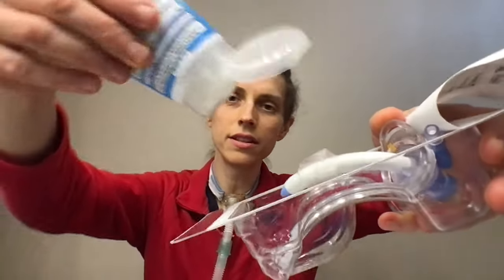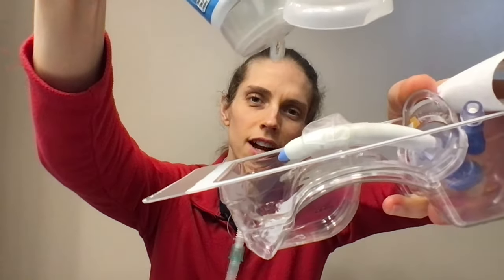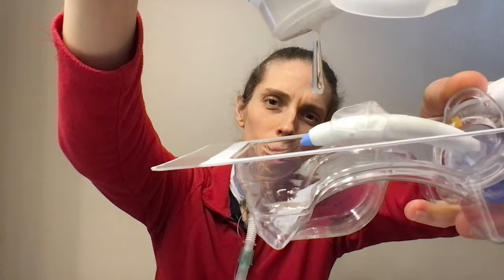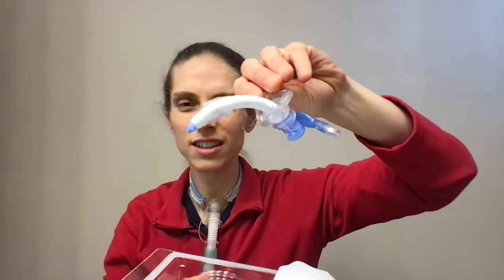Okay, got this tiny little bit. Whoa, here we go. That's a lot, but oh well. Come on. All right, so I got a tiny little bit on the end of my tracheostomy tube. I don't know if you can see that. It's just a tiny little bit. So now that I have that situated, I'm going to close this because I don't want this to accidentally fall or get all yucky. So bye-bye.